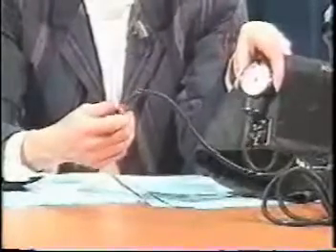The bulb can be held in either hand. It's usually most comfortable in your dominant hand. I happen to be right-handed, and so it works best for me to place it in my right hand. And the valve can be turned clockwise. If it's turned clockwise, then you are closing the valve. And when the valve is closed, then you can pump air into the balloon-shaped bladder of the sphygmomanometer cuff. By turning the valve counterclockwise, you release the air and the cuff will deflate.